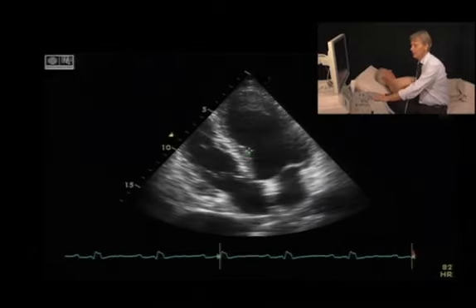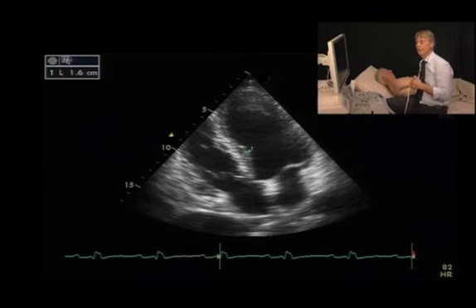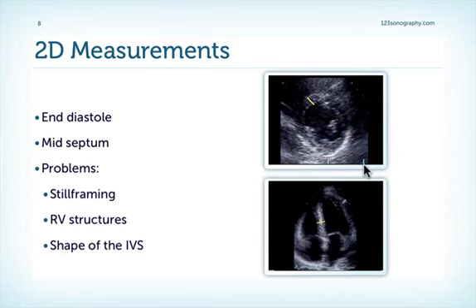Then I perform a measurement of the septum, which I would perform in a region of the septum located where you would also measure the M-mode. So it's between the mitral valve and the papillary muscle. However, I would avoid measuring the maximal thickness if the patient has prominent mid-ventricular septal hypertrophy. So I would then measure somewhere below or above this region. Here are two examples where you can measure the septum in a short axis view and a 4-chamber view.